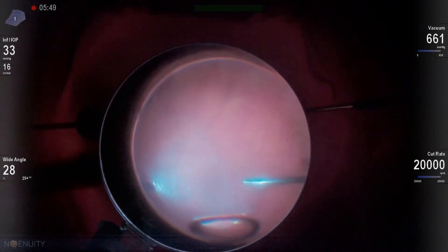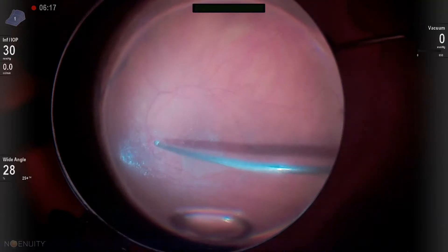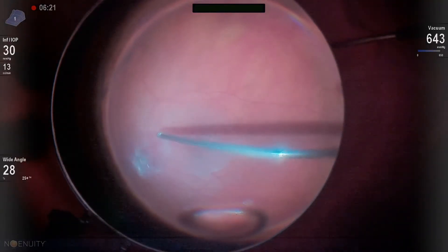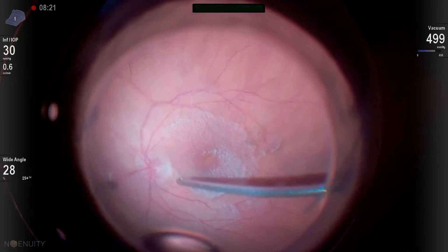I really do like to use intravitreal triamcinolone, usually diluted one-to-four or one-to-eight. That allows me to see the vitreous and know that I've occluded the cutter properly and that I'm elevating it. You can see this nice fine dusting.